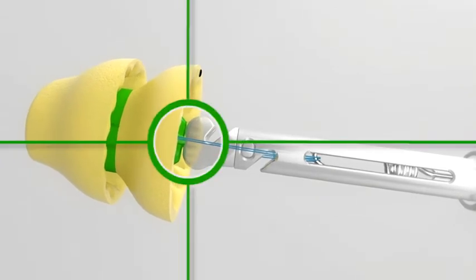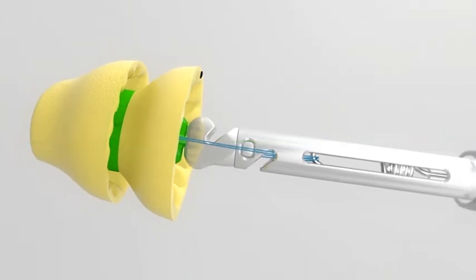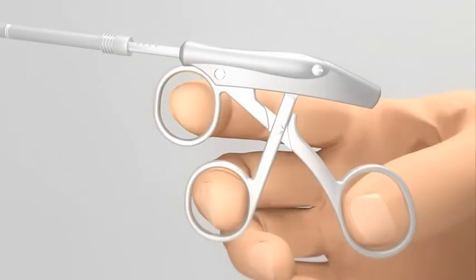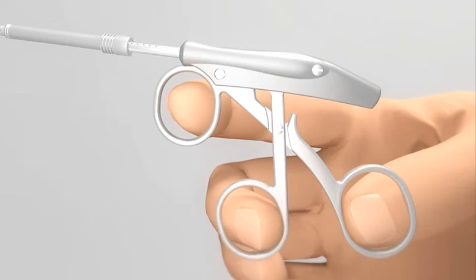Make sure that the handle of the sizer is completely engaged in the tip notch. Use the moving tension ring to adjust the tension of the sizer. Squeezing the rings releases tension. Spreading the rings apart increases tension.